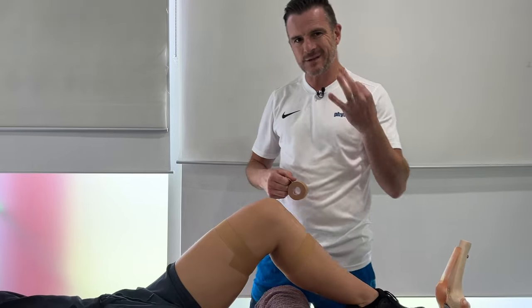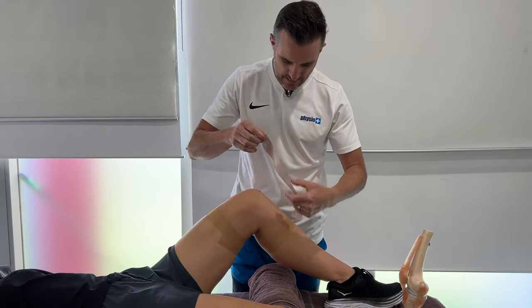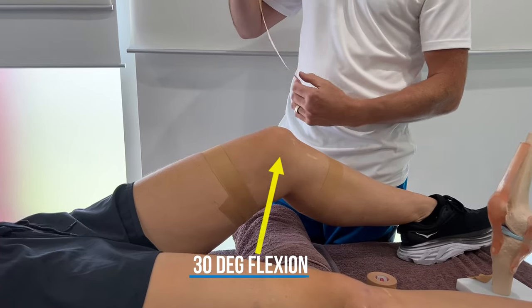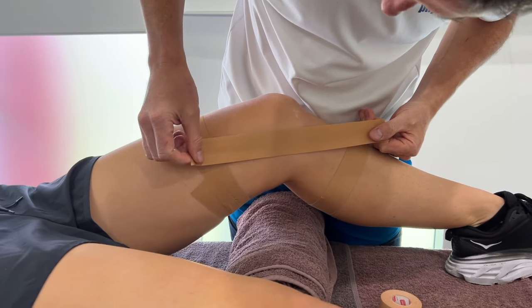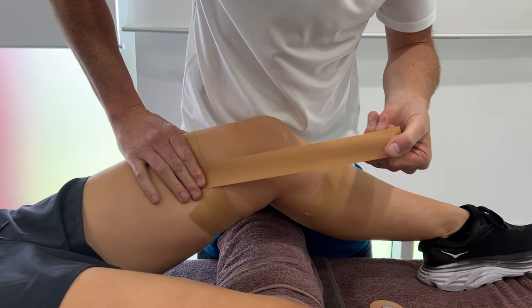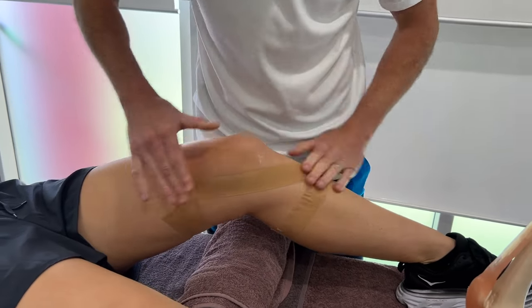We're going to aim for three angles, done twice. First, go straight down the middle of the ligament. Have the knee in a little bit of flexion — about 20 to 30 degrees — not fully straight. Think about where that ligament runs and go straight through the middle of it. Hold it down to make sure the anchor doesn't slip, then pull it really tight around that soft tissue and anchor down on an angle, coming sort of across.